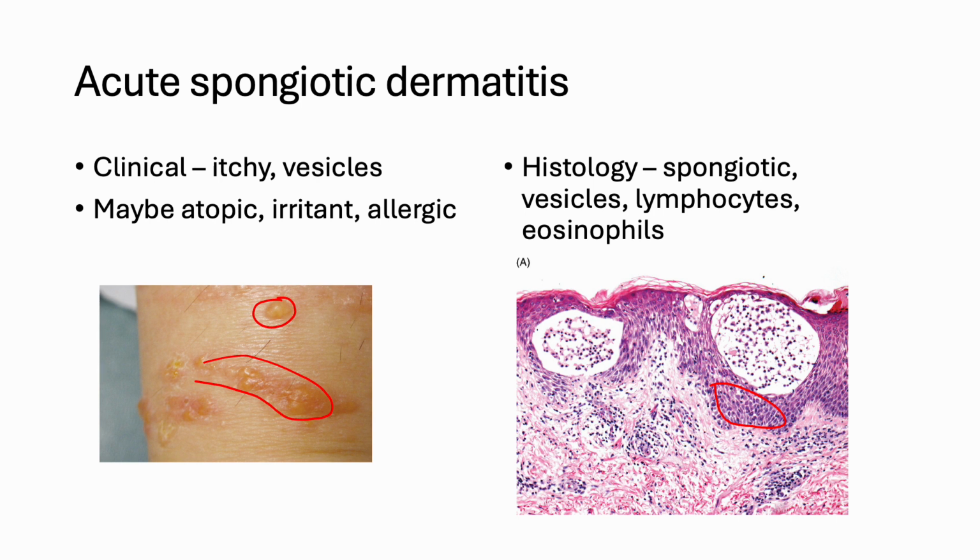And if there is a continuous increase in the fluid, when the desmosomes cannot hold each other, there will be a vesicle. And usually in the vesicle there can be inflammatory cells. The inflammatory cells can include neutrophils, lymphocytes, and sometimes Langerhans cells. The Langerhans cells are antigen presenting cells, usually more indicative of contact dermatitis. Also there can be numerous eosinophils inside the dermis or in the epidermis. So this is the acute spongiotic dermatitis.